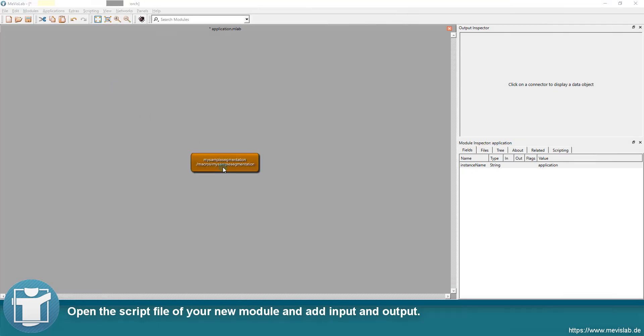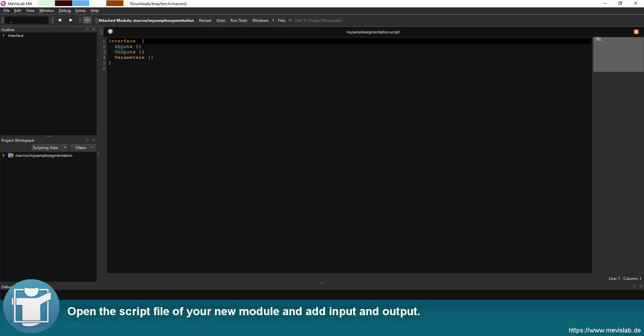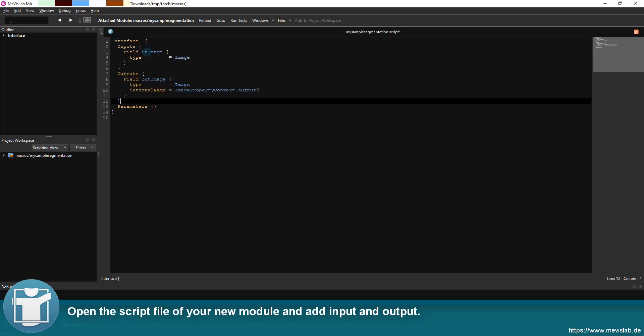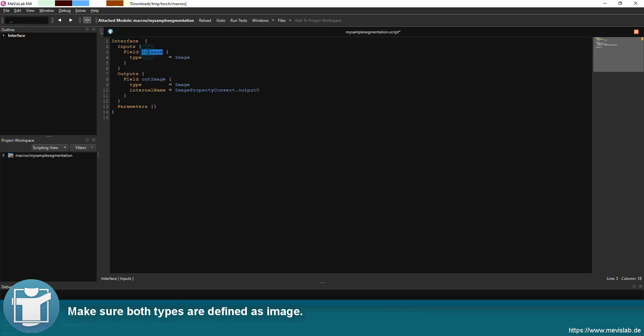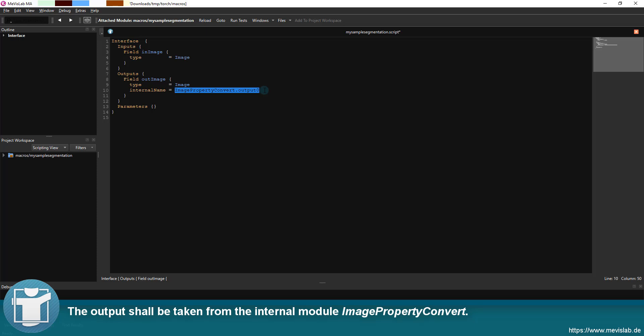Open the script file of your new module and add input and output. Make sure both types are defined as image. The output shall be taken from the internal module image property convert.